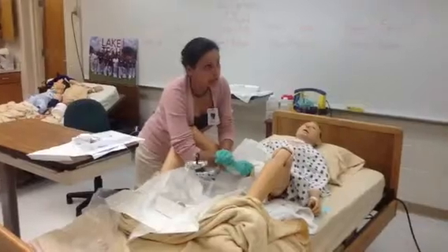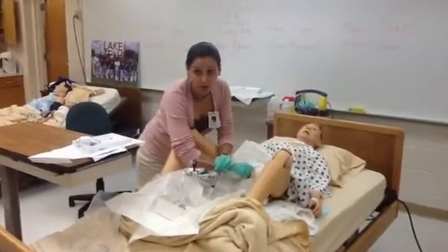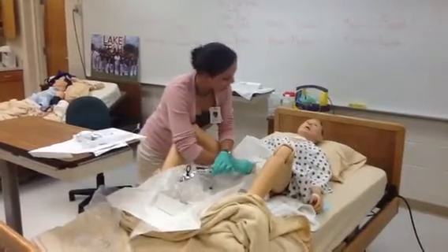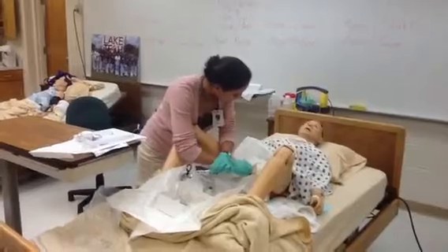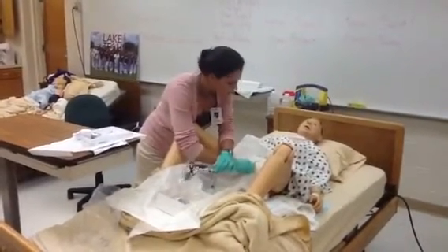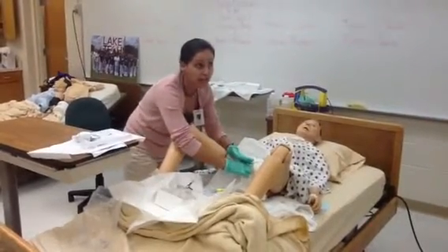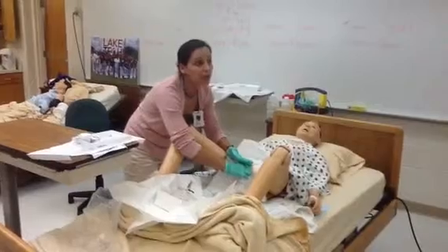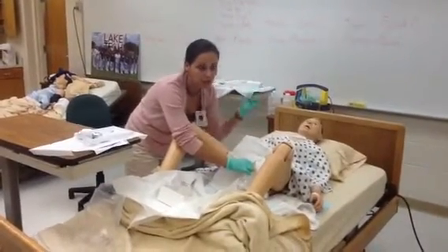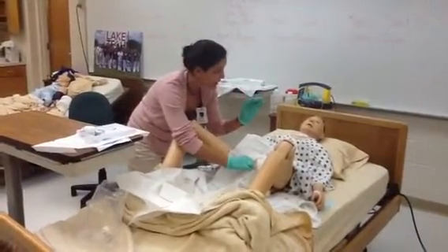As soon as you see the gold, the urine, you pass the catheter 1 to 2 more inches. So now that I've seen this, I'm going to continue to advance my catheter another inch. Get it in there. Now, this hand is going to hold the catheter exactly where it is. If I let this hand go, the natural reflex of that entire musculature right there is going to be to push that catheter out, and it will slide right out. So I have to hold it exactly where it is.